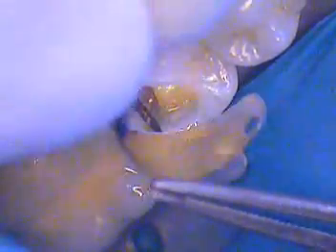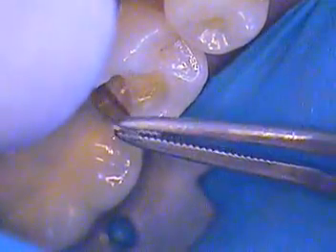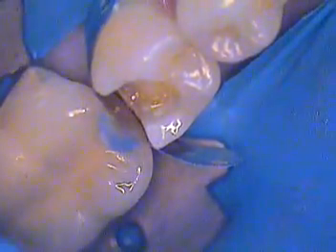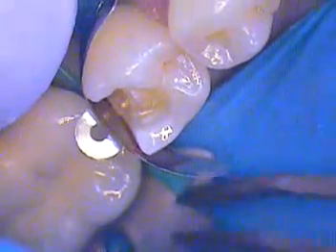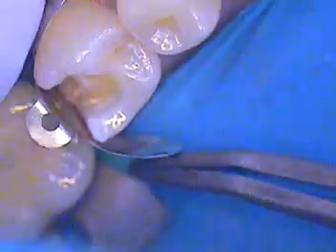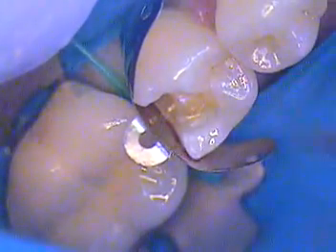We're going to go ahead and place our composite matrix band. I like the Garrison company — they make a very nice tapered band, there are others on the market. Now I'm going to apply an Almar wedge, it's a green plastic wedge. We'll try it from the lingual; if not, we'll come from the facial aspect. We're going to get some separation here between the adjacent crown and tooth. Nice and tight in there — the tighter the better.